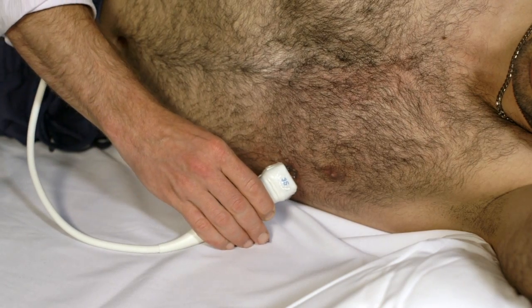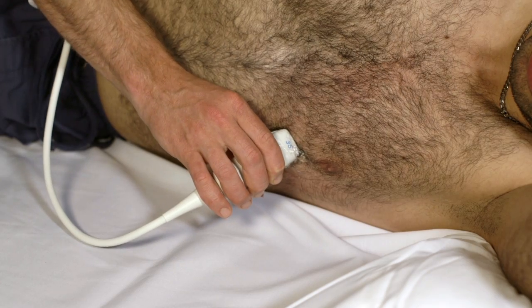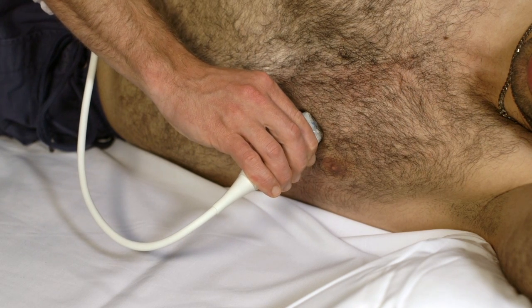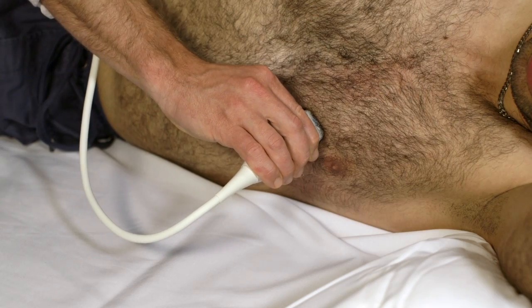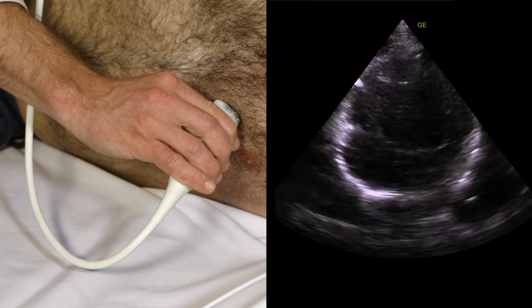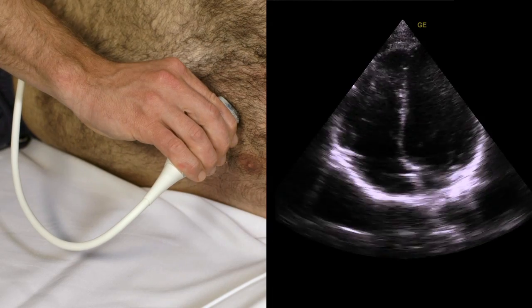Begin by placing the transducer in the cardiac apex area. This is often just inferior and lateral to the nipple in men, or at the base of the left breast in women. Aim the ultrasound beam towards the right axilla. Rotate and sweep the transducer with small probe movements as necessary to obtain an ideal view. If the septum is at an angle, slide or rock the transducer until it becomes vertical. Usually the apex is to the right of the screen, so the correction is to slide laterally.